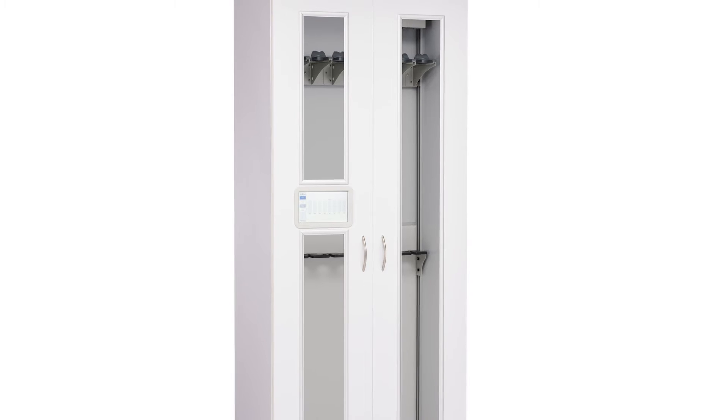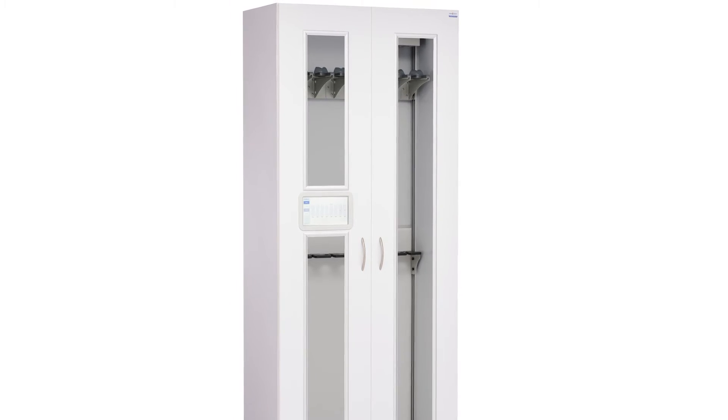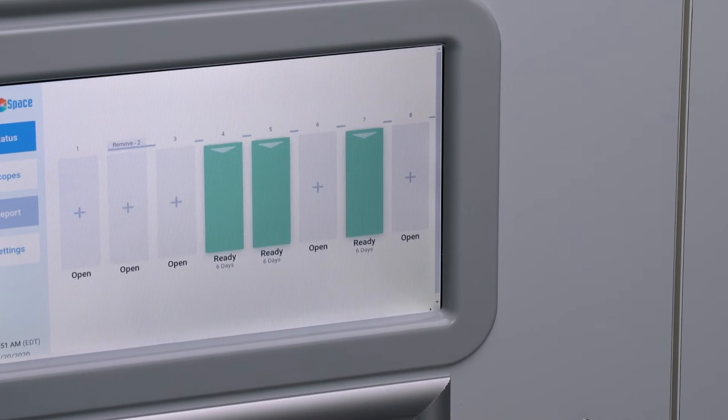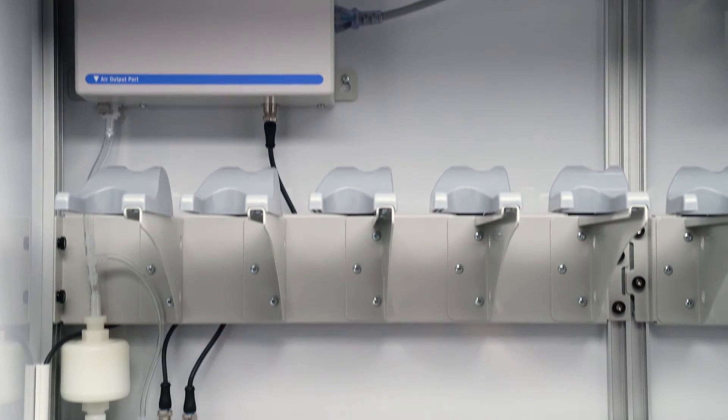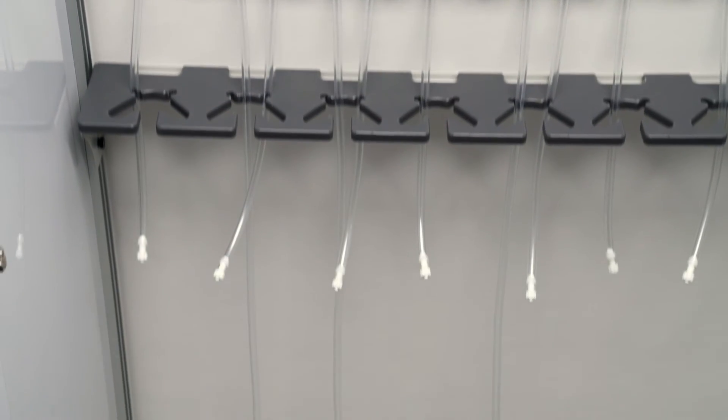The Ventair line also includes a scope tracking cabinet and offers a cost-effective, efficient way to monitor scope storage and both drying and tracking and tracking retrofit units that are installed in existing Innerspace Evolve scope cabinets.